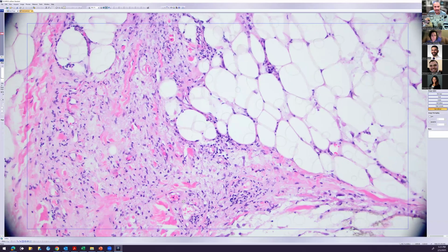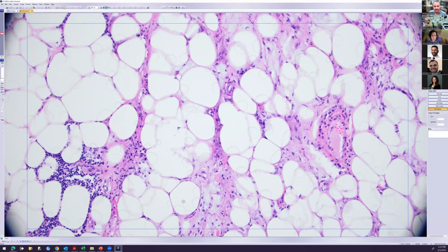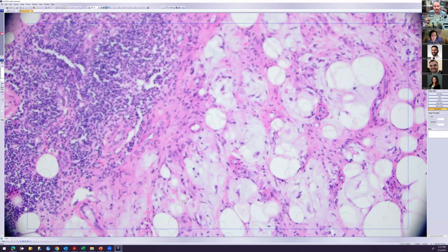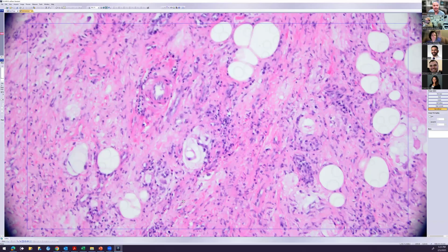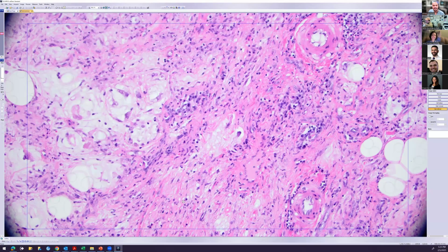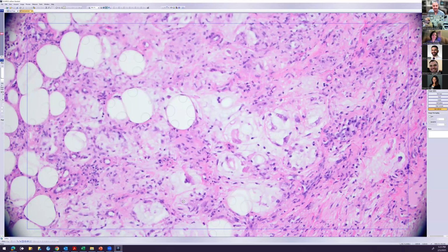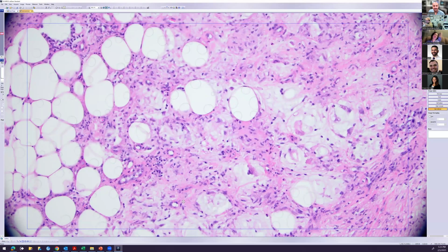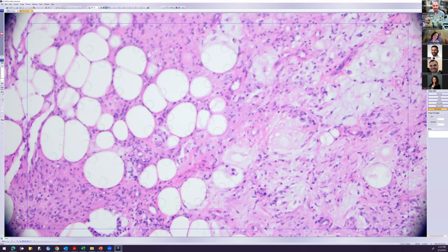So this one has a background of a somewhat related tumor called hemosiderotic fibrolipomatous tumor. We're not actually going to talk about that today, but it can occasionally be seen with one of two other neoplasms that are somewhat related, though the relationship is kind of dubious, to be honest.